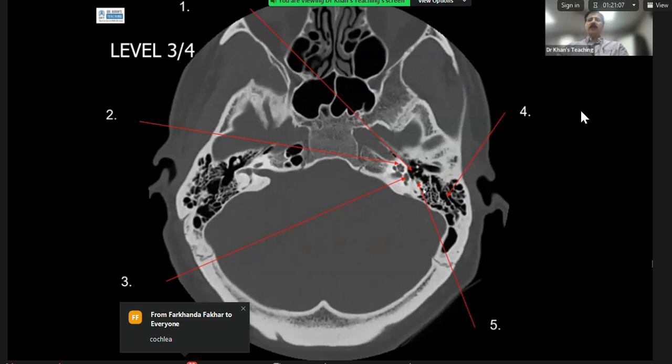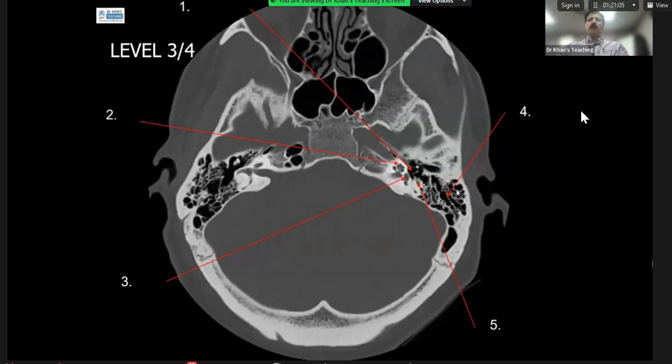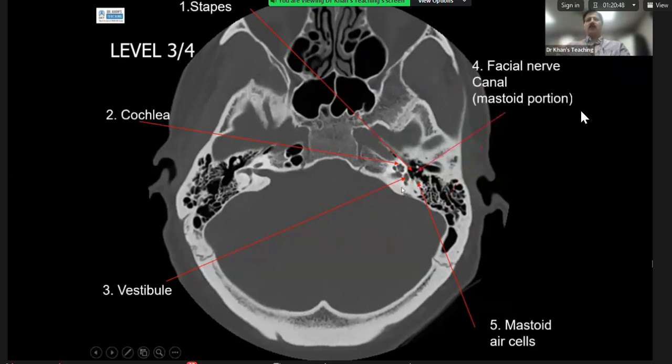Okay. Number 4. Number 5. Pyramid. Okay. Let's go through them.